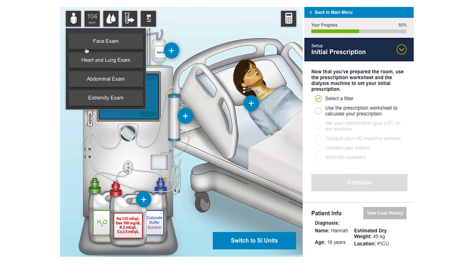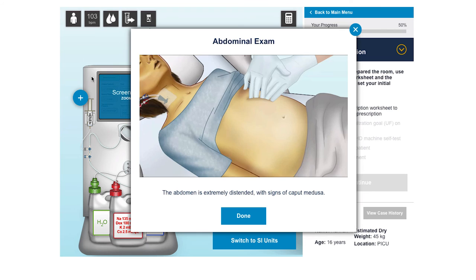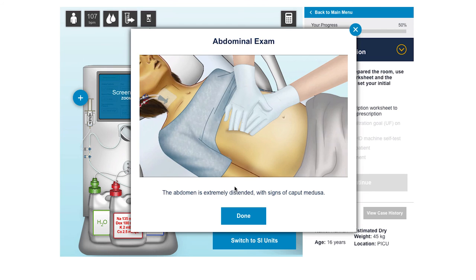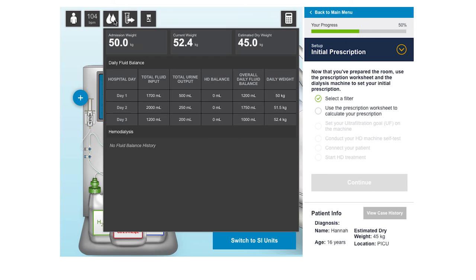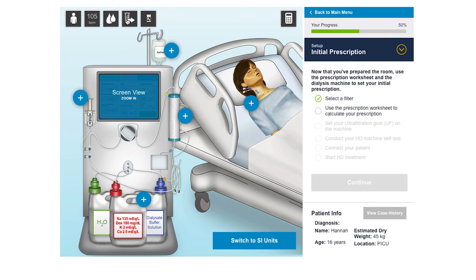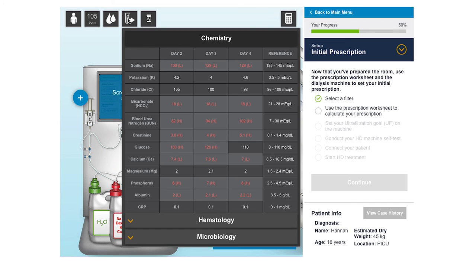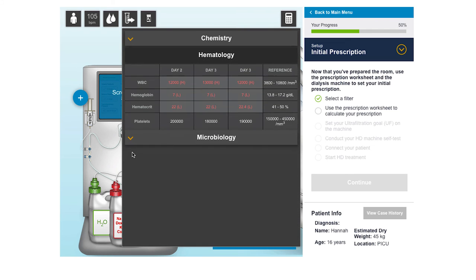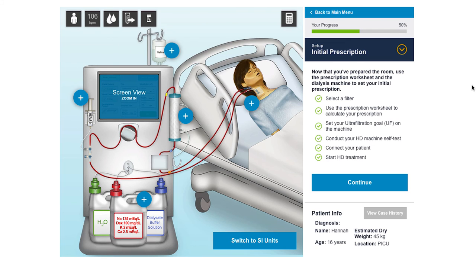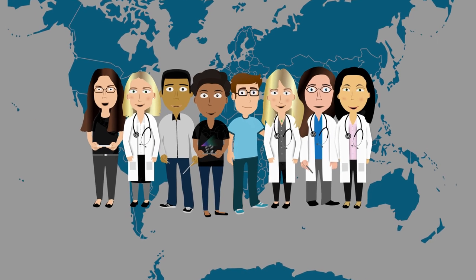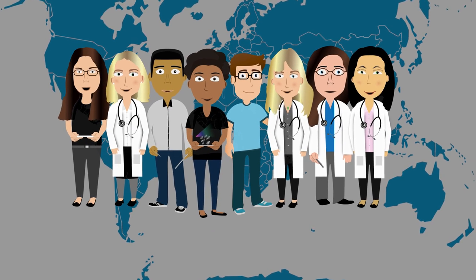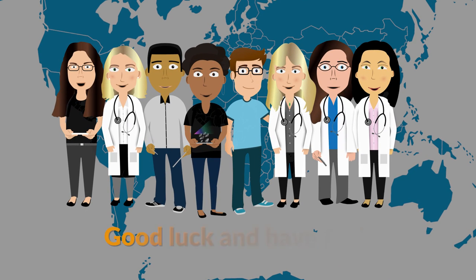We hope that our hemodialysis simulator will provide an interactive and scalable experience for the learner to acquire basic knowledge about hemodialysis, practice their skills in a safe environment, and receive direct feedback on their actions, all while controlling the pace of their learning. We hope you enjoy your experience, good luck, and have fun!